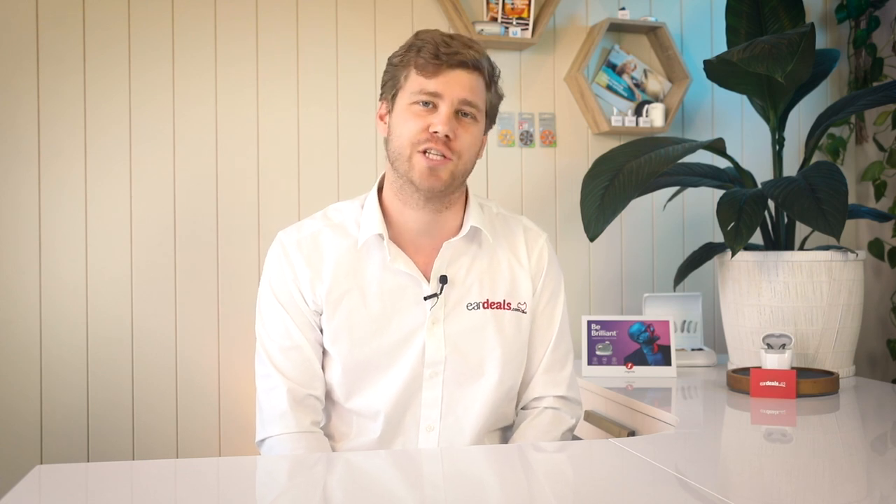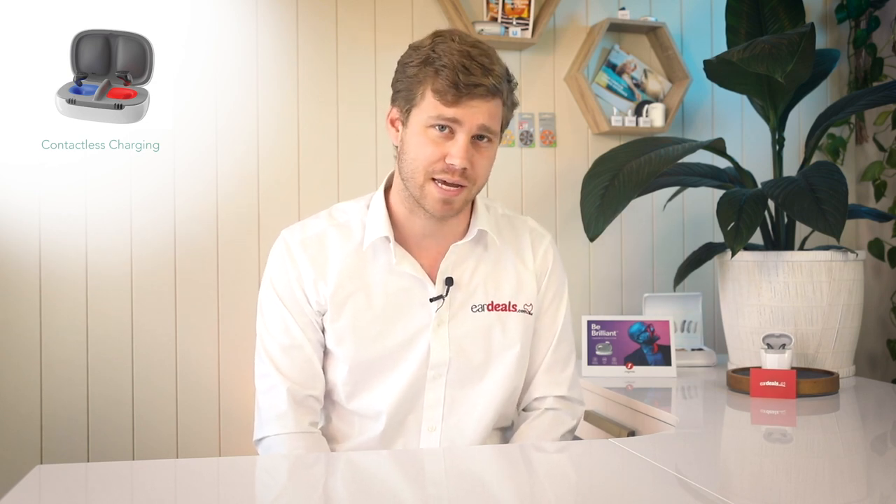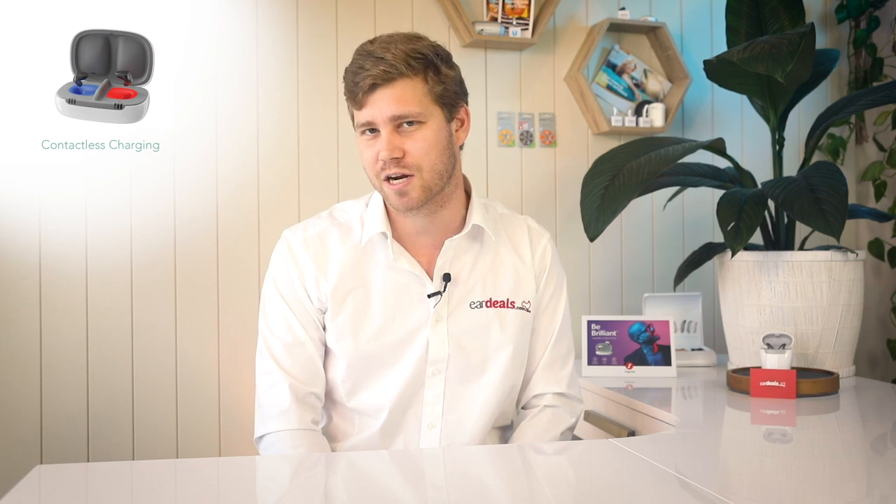Why are we excited today about the new Signia INSEO? It carries the Charge and Go title — and you guessed it, it's rechargeable. It's actually contactless rechargeable with its own case, making this a highly sought-after device with stable rechargeable capability from one of the largest manufacturers globally, and it's highly discreet, or arguably invisible.